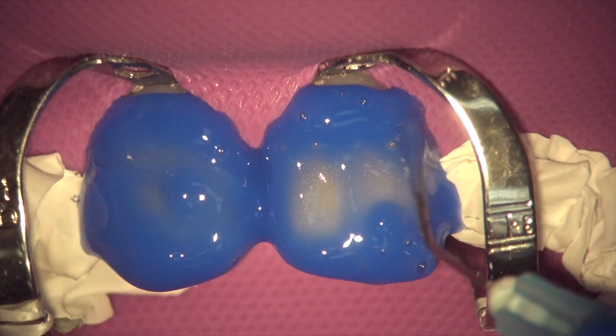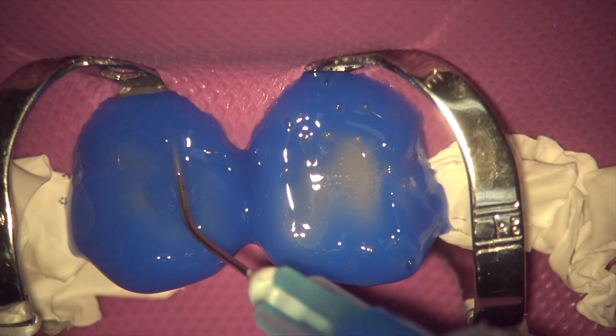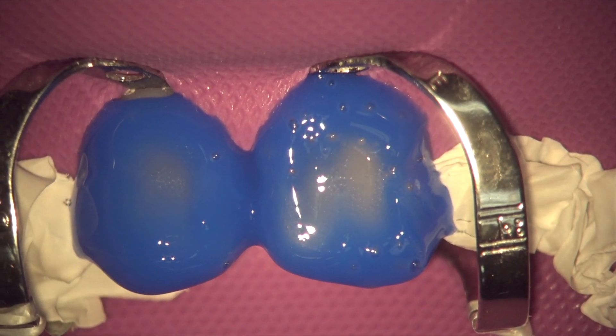If you etch for 10 seconds, rinse it, dry it, you'll clearly see the differentiation between enamel and composite. And if you're removing old veneers — really conservative veneers where there's still enamel everywhere — but you want to make sure you got all the porcelain off during a replacement or revision case, that's a tough one sometimes too. Etching the surface allows you to see the difference between the enamel and the porcelain, because the porcelain is not going to etch and get frosty like the enamel will.